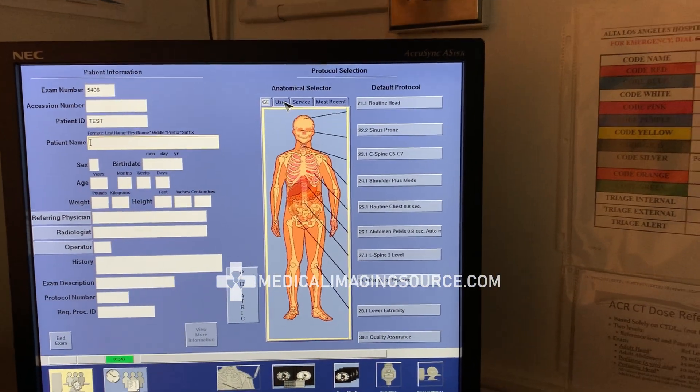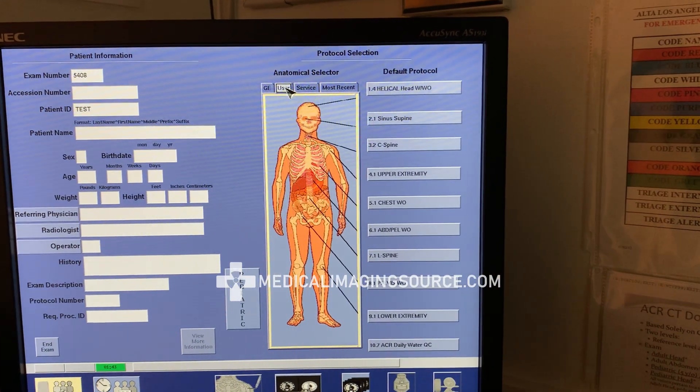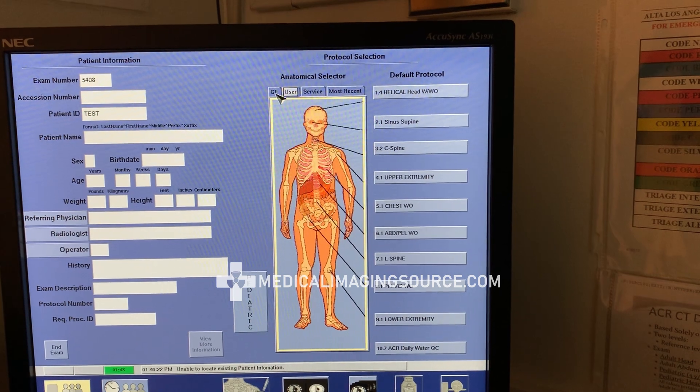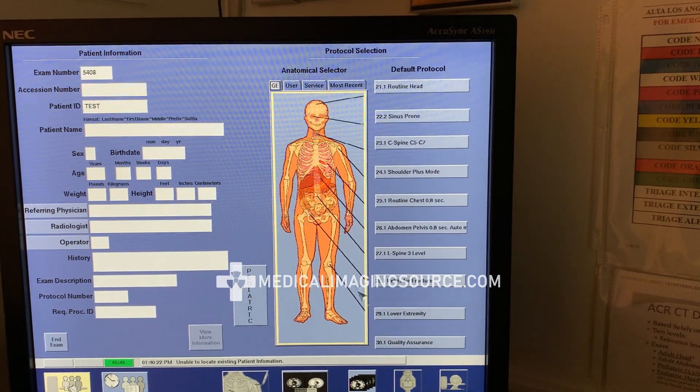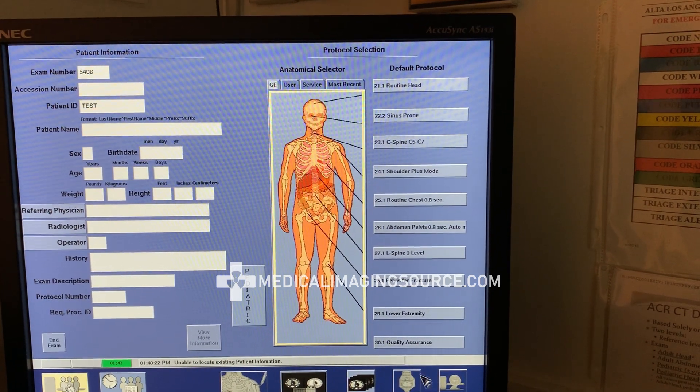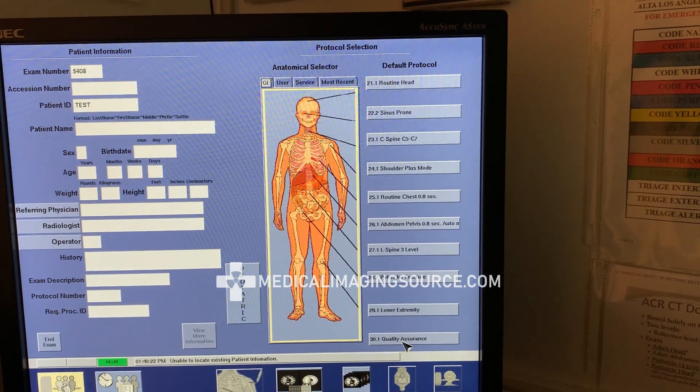You're typically going to be on the User tab, but you can scroll over to the GE tab and you should see Quality Assurance down at the bottom.